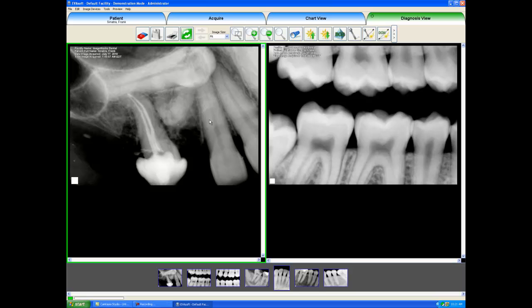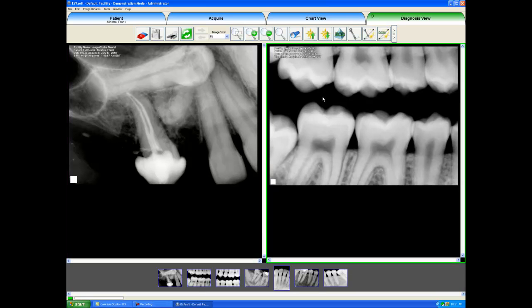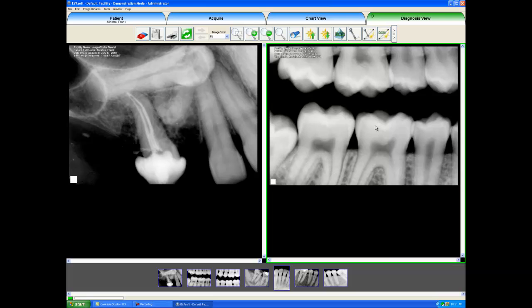We note the green border around this window showing that this is our active image. When I do image manipulations, we will be focusing on this image. To get to the other image, I just single left-click that, and then we can see that the green border goes around that image.